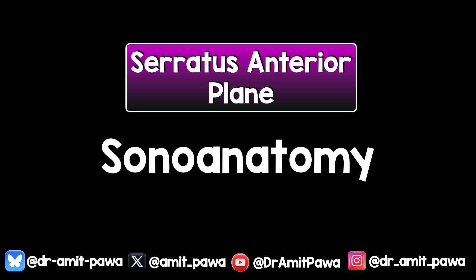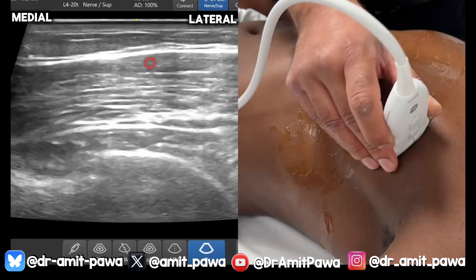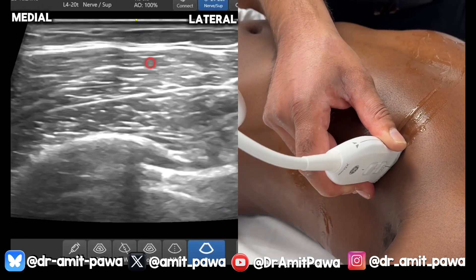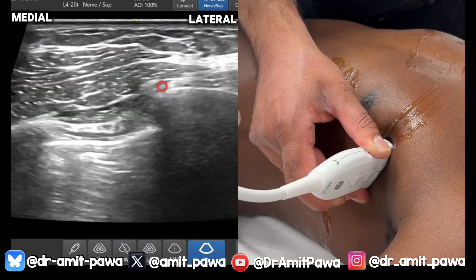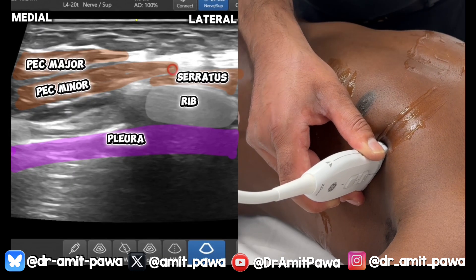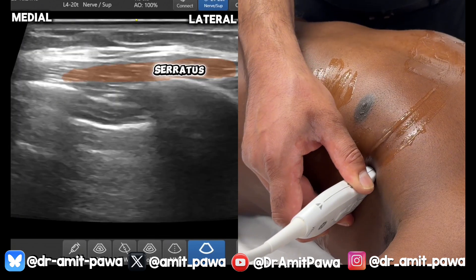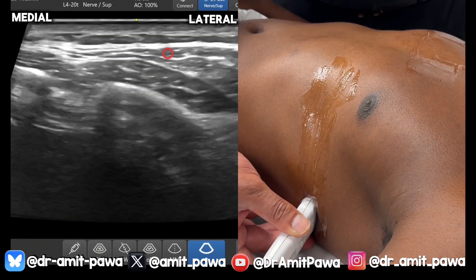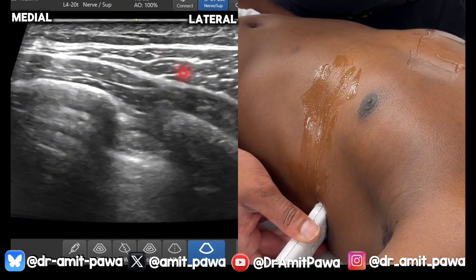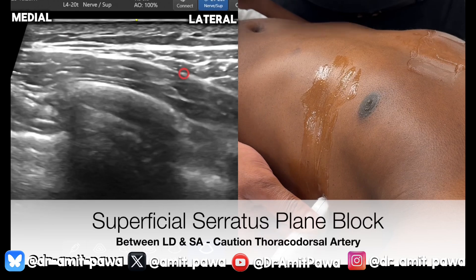Now we're going to move on to the sonoanatomy and scanning. I'll show you two approaches: one coming from the anterior part of the chest wall, over pec major and pec minor, and a second scanning further down and around the posterior aspect where we see serratus lying over the ribs. Here's pec major overlying pec minor above the ribs and the pleura. Scanning posteriorly, pec minor ends and meets an anterior digitation of serratus anterior overlying a rib. Continuing posteriorly, serratus anterior is the only muscle over the ribs, and you can follow it as it overlies all of the ribs. Further back, latissimus dorsi comes into view overlying serratus anterior, and you see that anterior triangle of LD.